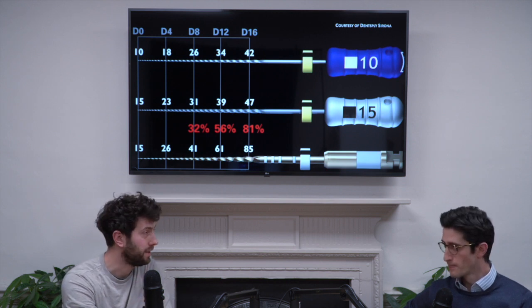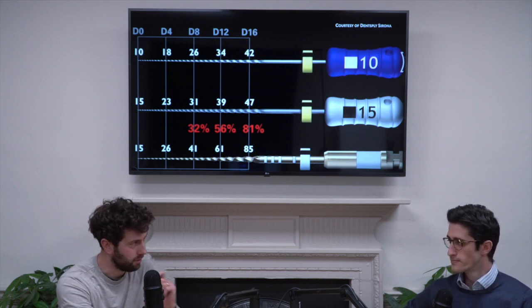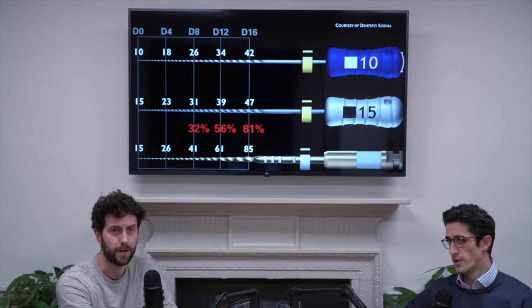And being nickel titanium, which the Gold Glider is, it does help with that transition as long as that 10 has gone down and is reproducible at length.